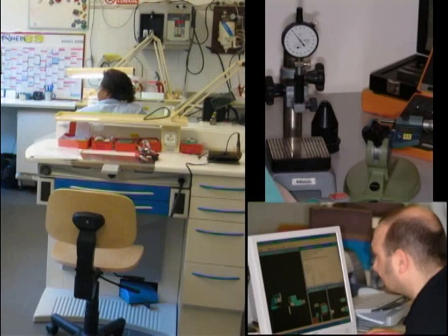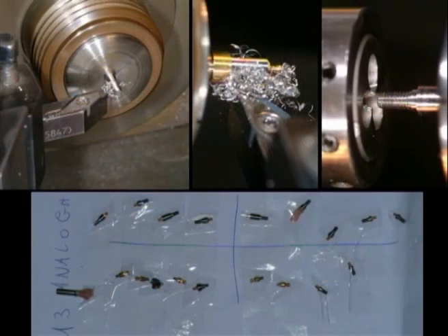Assisted by a mechanics specialist and a dental technician, the dentist worked with skill in the patient's mouth to determine the correct measurements in order to manufacture, especially for this case solution, all the abutments, analogs, and threads necessary for the stone models. Without these custom-made components, this case would have never been resolved.